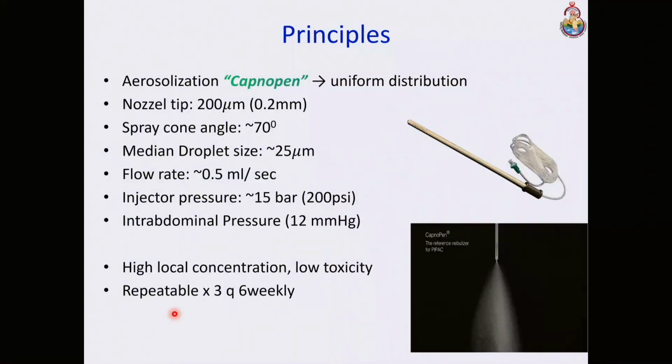So what is the basic principle governing this? There is a specialized pen. I will be showing you in some time, the Capnopen. This was a prototype. It's a type of nebulizer. There are other companies also manufacturing it. So it causes aerosolization that you can see. This is the pen, how it looks, and this is what nebulization actually means. This is how a shower, a Swiss snowstorm appearance of the drug, comes out once it's in use.